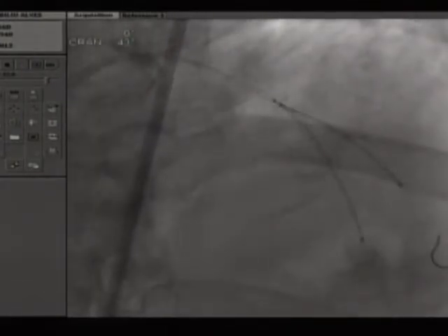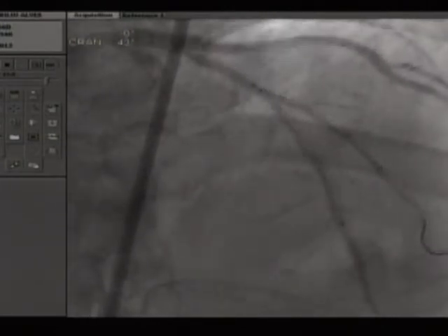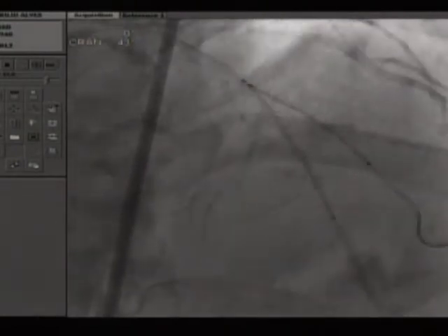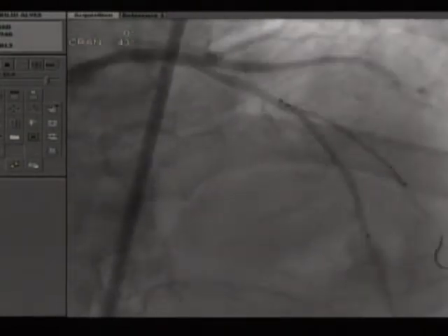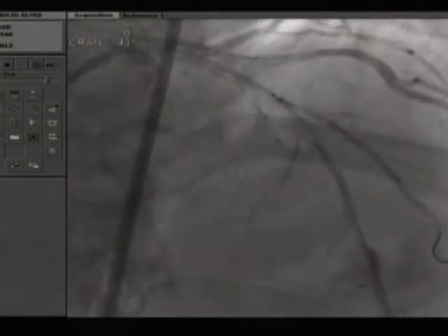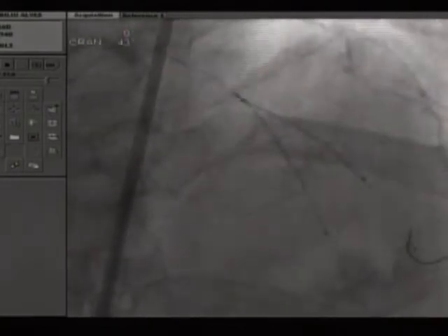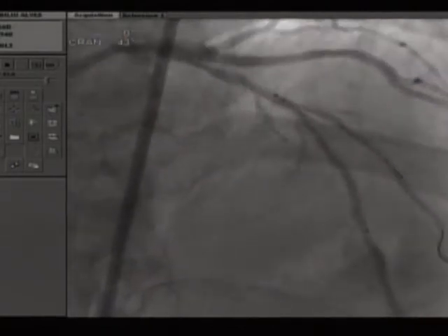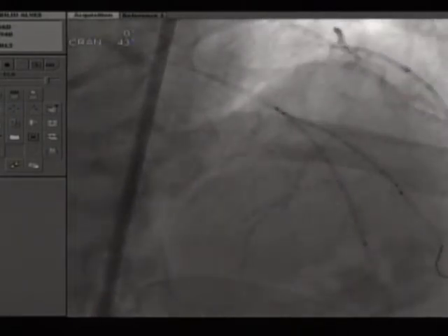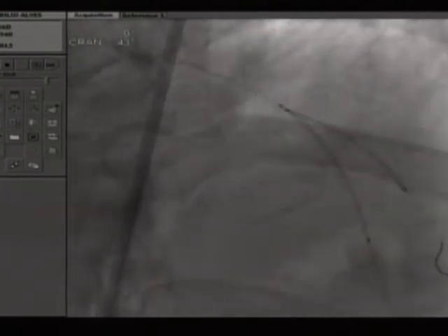Can I make a comment on the positioning now? I would probably not leave it the way it is now. I would push the diagonal a little bit more in, because now you have fairly close four layers of stents, and if you rewire it, you might actually encounter a little problem, and you don't really need it. You covered the ostium very well. So at least from this perspective, I would probably push the diagonal stent a little bit more in, so we have a little separation.